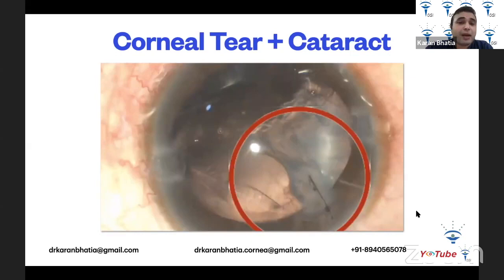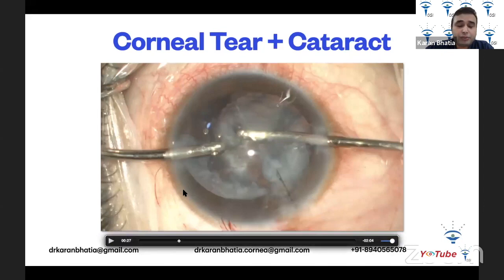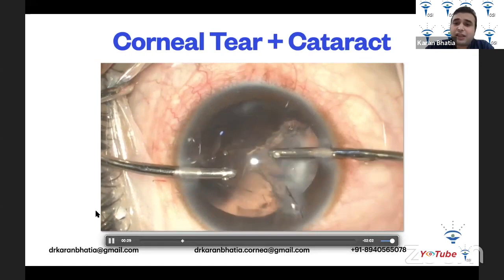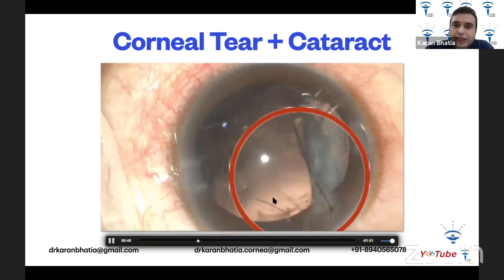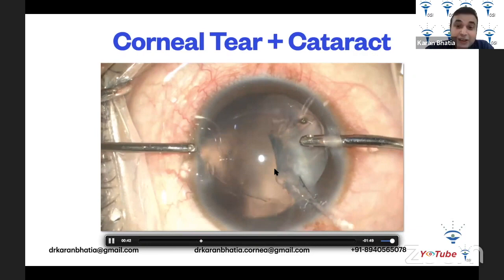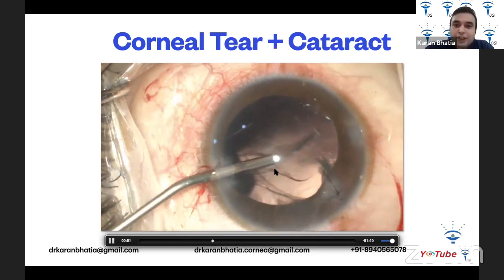If you don't have access to bimanual IA as a resident, you can use a SIMCO cannula. During surgery, while proceeding quickly, look for anything unexpected. In slow motion review, after removing the lens matter, you can see a round structure — this is a posterior capsular tear that was present beforehand. Always expect there could be a posterior capsular breach.